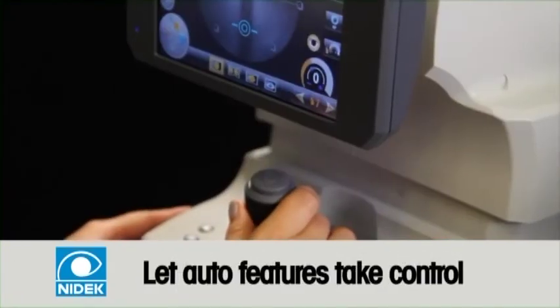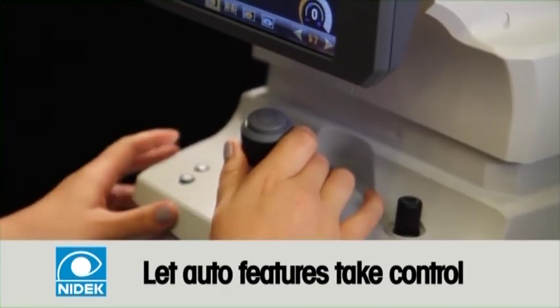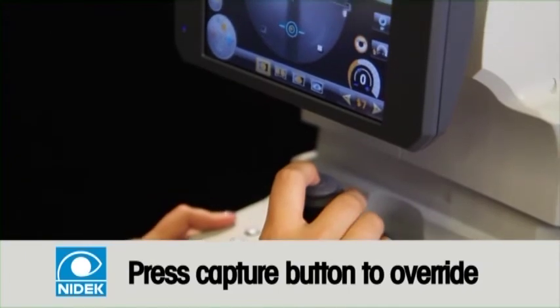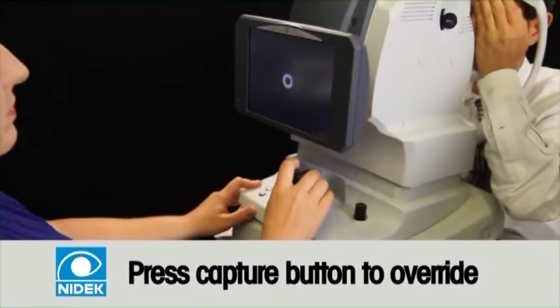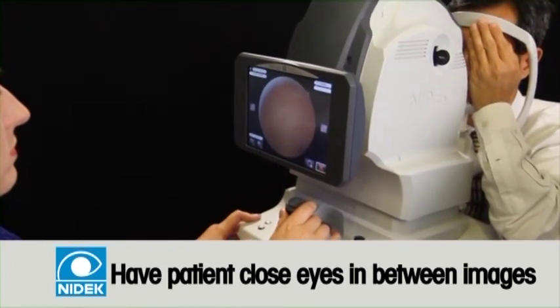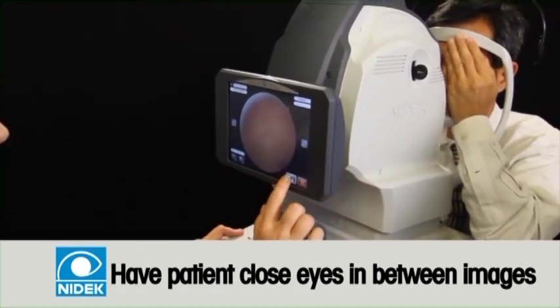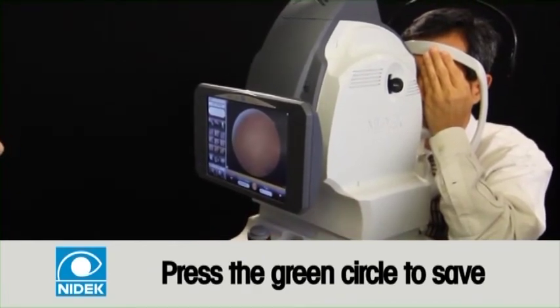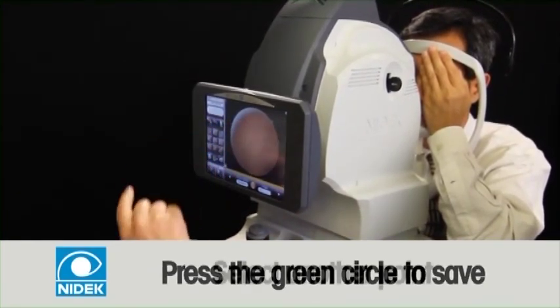The camera's automatic features will take over and the image will be captured. If needed, the operator can press the capture button on the joystick to override and capture the image. After the image is captured, have patient close their eyes until the operator is ready. While the patient's eyes are closed, press the green circle to accept and save image, or press the red X to delete and retake image.